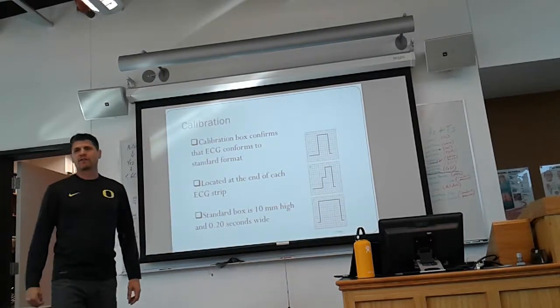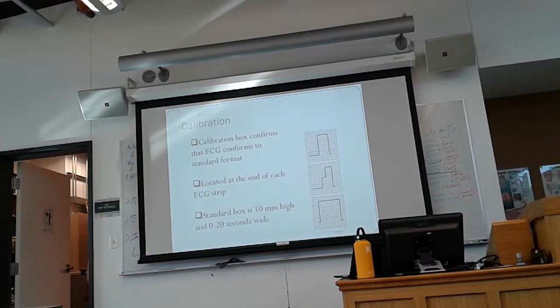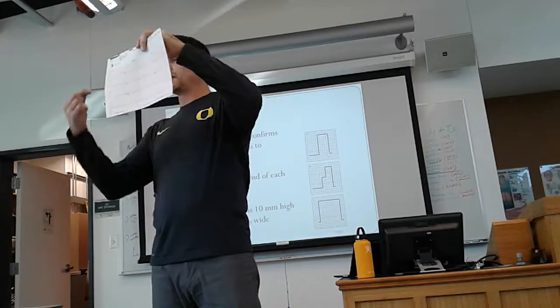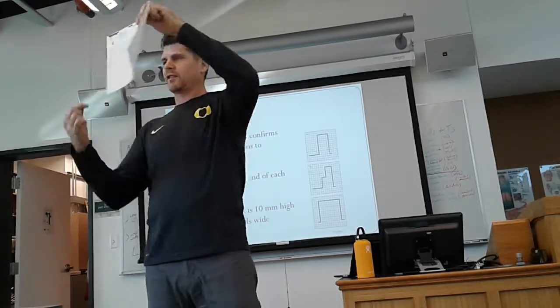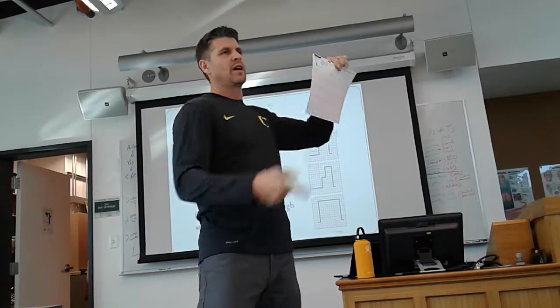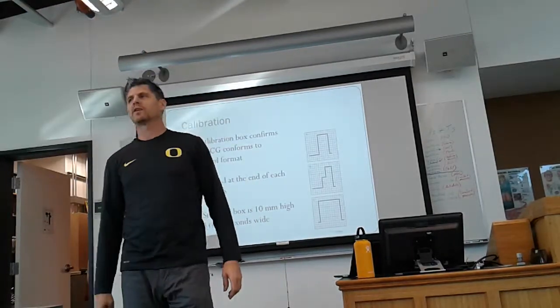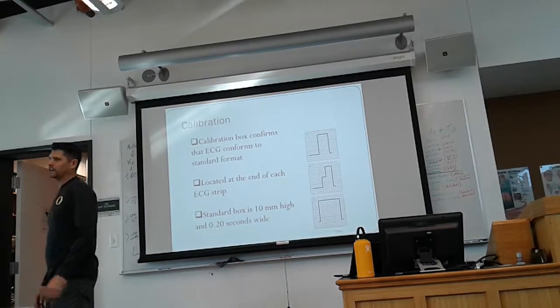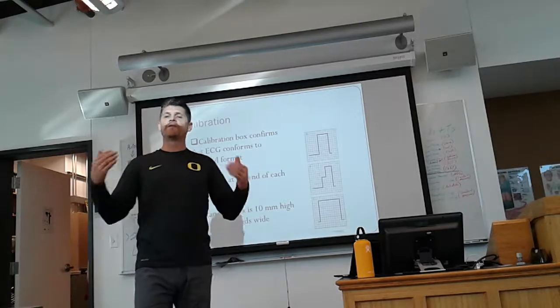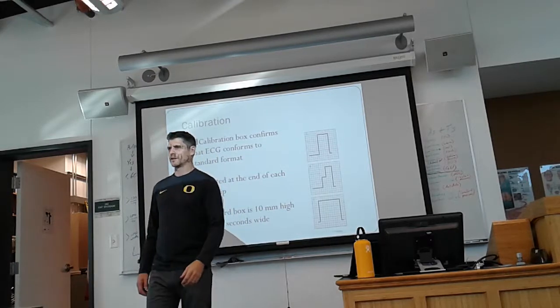At the end of your 12 leads and at the end of some of your other ones, sometimes at the beginning, so either at the beginning or at the end, you will see this rectangular box. See that rectangular box that starts it? That's a calibration box. You do need to pay attention to the calibration box to make sure that you're calibrating correctly. All of our monitors, unless we've modified them, should default to a standard calibration.